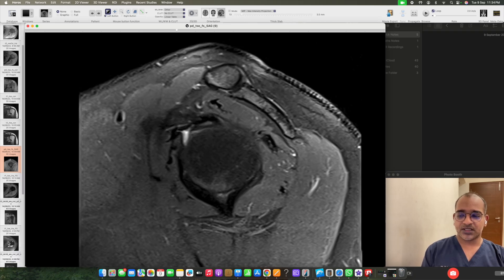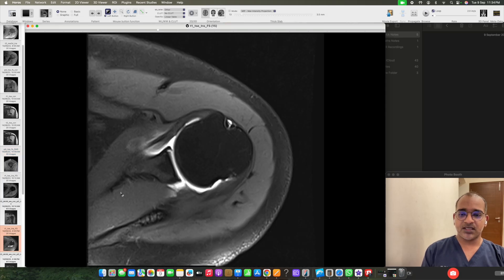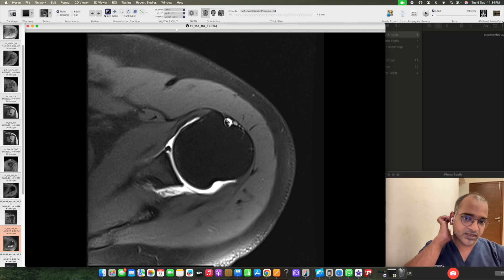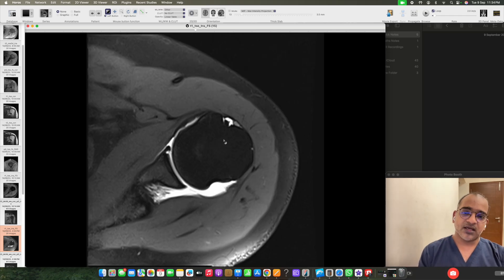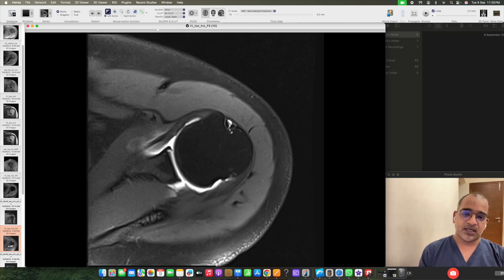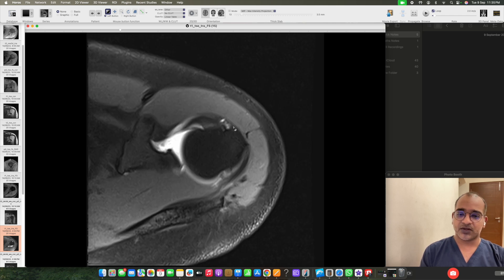For the same patient, an arthrogram was done. On the arthrogram, we can better see the anatomy. Here we can see the long head of biceps tendon and the transverse humeral ligament. This part is formed by the medial band of coracohumeral ligament and superior glenohumeral ligament complex, and this is the lateral band of coracohumeral ligament.